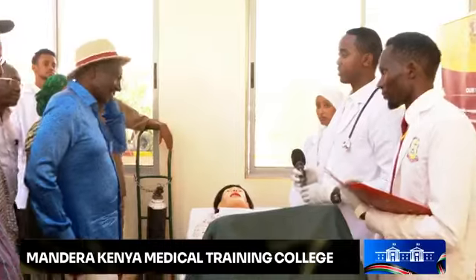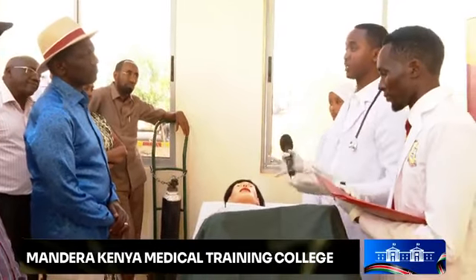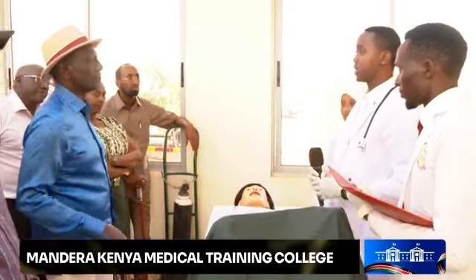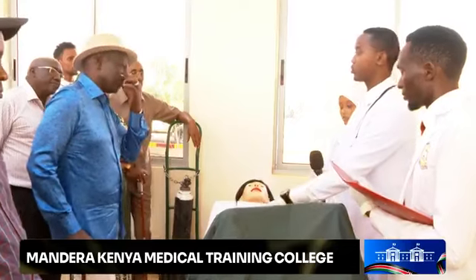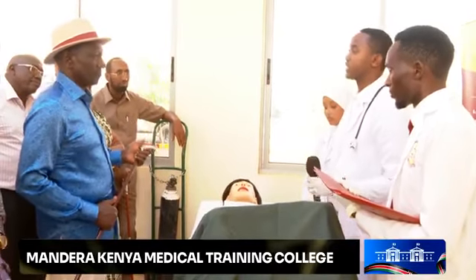that I will use. Before you is a patient who has a problem with bladder incontinence, maybe as a result of a health-related condition, or even growth within the tract that the urine passes through. They may get obstructions, and this will lead to accumulation in the bladder. So when a patient develops such conditions, we have a procedure for them, and that procedure is catheterization.